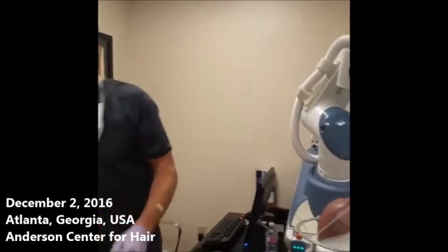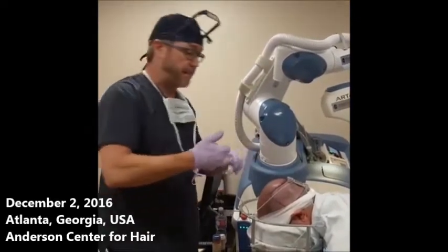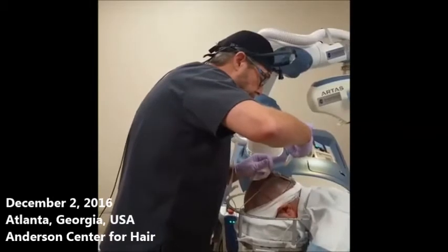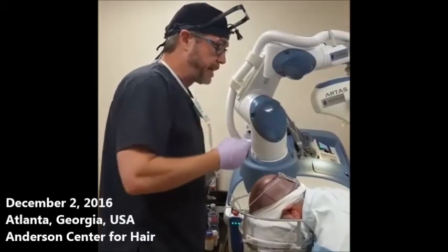Now I'll take a little bit of normal saline, and sometimes in the corners — because the head is a round surface and the robot likes it flat, especially in the upper corners — we're going to inject a tiny amount of saline there.